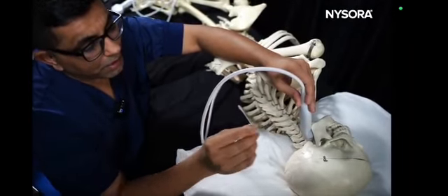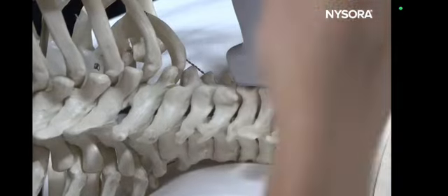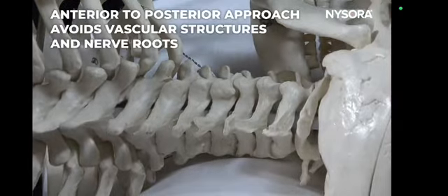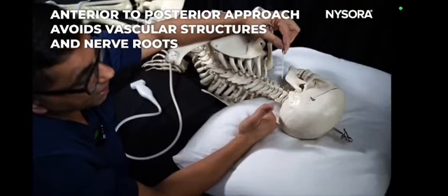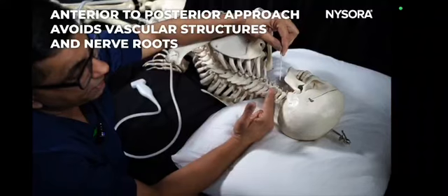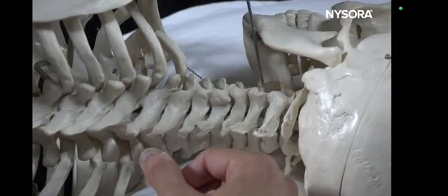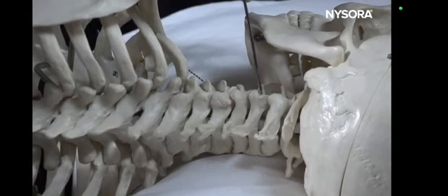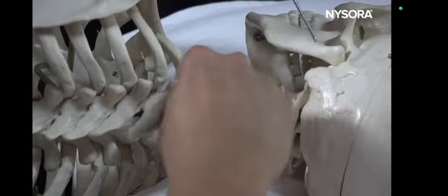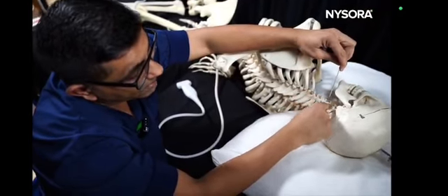Clinical tip here, or the pearl I would like to tell, is you always go from anterior to posterior. Why? Because when you go from anterior to posterior, you're avoiding all the important structures, including the carotid artery, vertebral artery, and nerve root. You will be bringing the needle from anterior to posterior, landing into that trough. Now, if you miss the bony target, then still you will be safe because you will be ending in the posterior cervical paraspinal muscles.